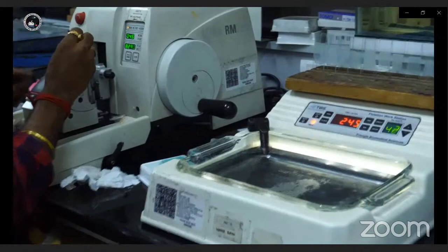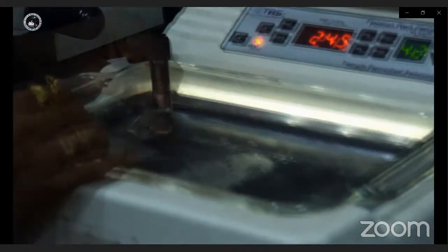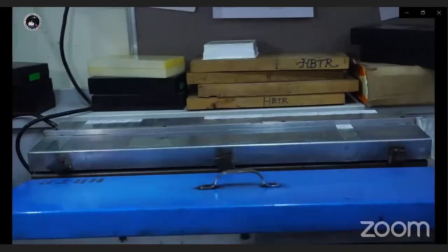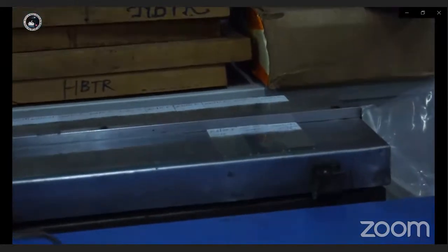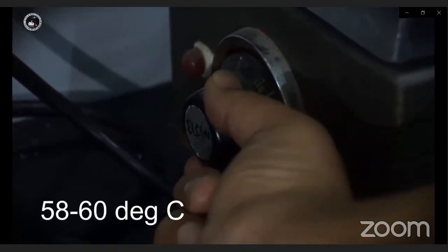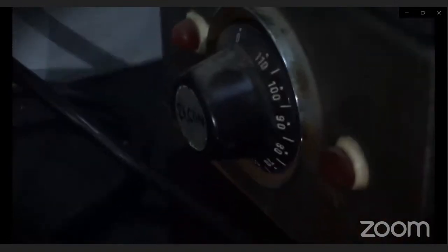Immunohistochemistry is a technique of detecting specific proteins in tissue sections by using the principle of antigen-antibody reaction with suitable enzymes and substrates, which form thick insoluble precipitates that can be visualized under a light microscope. Collect 4 micron thick formalin-fixed paraffin sections on positively charged slides. The sections need to be fixed by heat, hence slides should be placed on the slide warmer for 1 hour at 58 to 60 degrees Celsius. Using positively charged slides and heat fixation are important to prevent sections from floating.